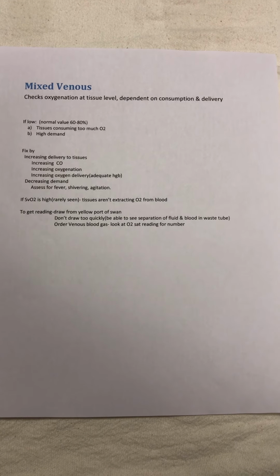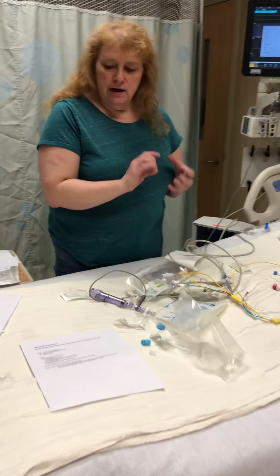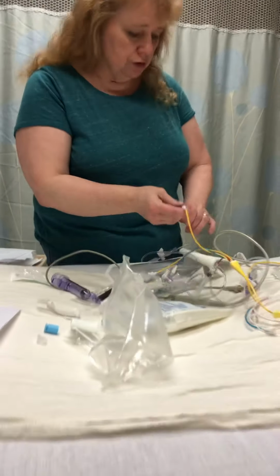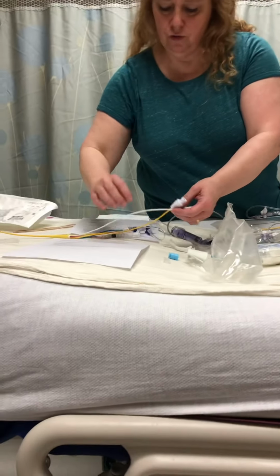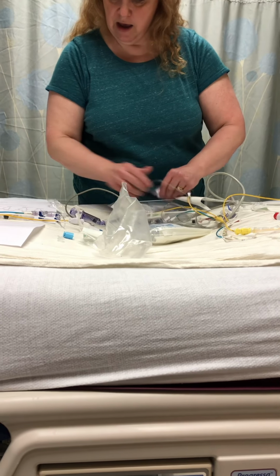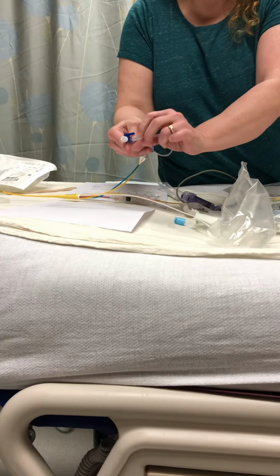When we're checking that, we take a look at our Swan and draw a number from the Swan. So what you're going to do when you do a mixed venous is put a syringe on the yellow port.